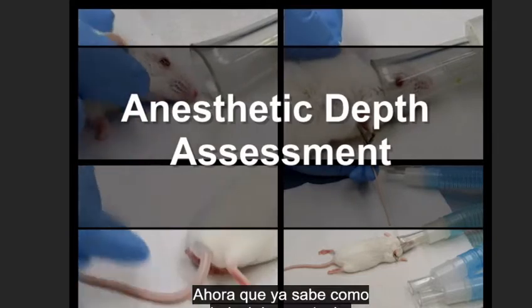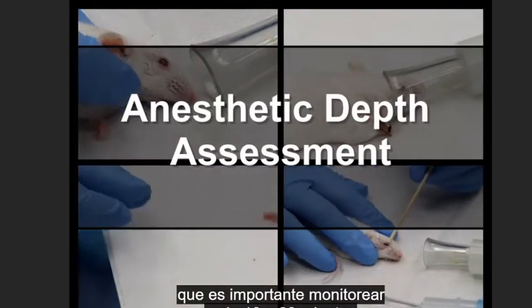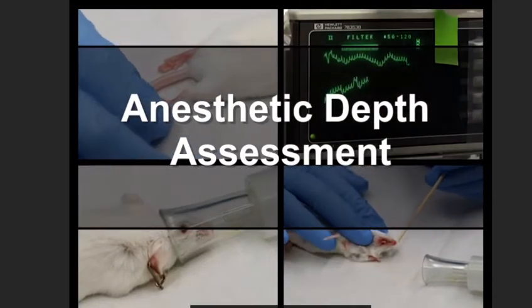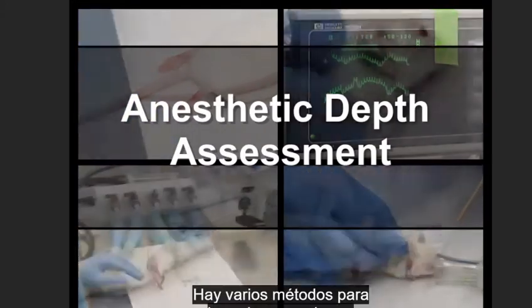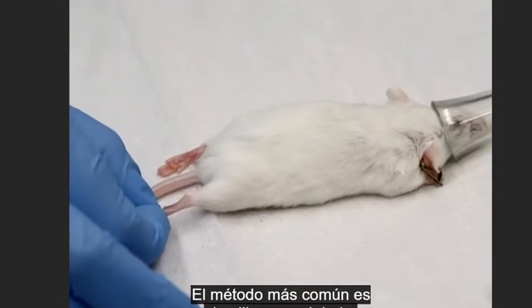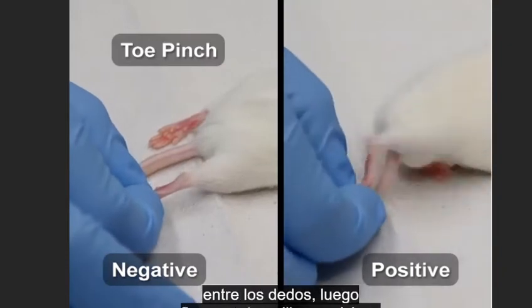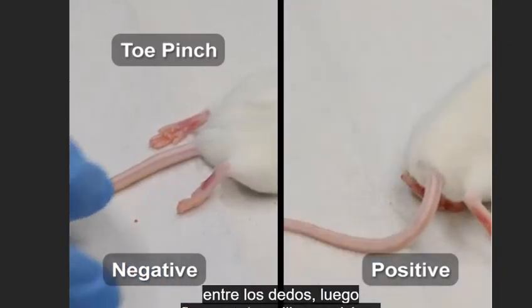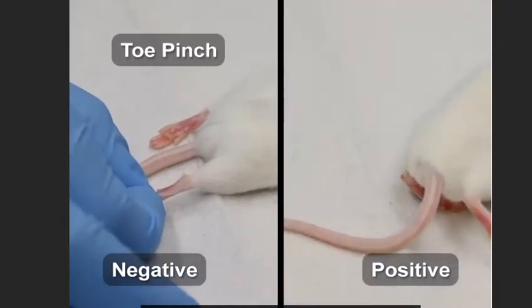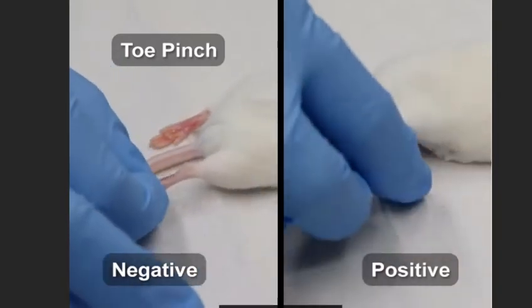Now that you know how to induce anesthesia, let's learn about anesthetic depth assessment, which is important to monitor every 10 to 30 minutes to ensure that the animal is not harmed during the procedure. There are several methods for doing so in rodents. A commonly used method is the toe pinch: extend the animal's leg and isolate the webbing between the toes, then firmly pinch the area using either the fingernails or atraumatic forceps. A positive reflex is indicated by retraction of the leg or withdrawal of the foot.